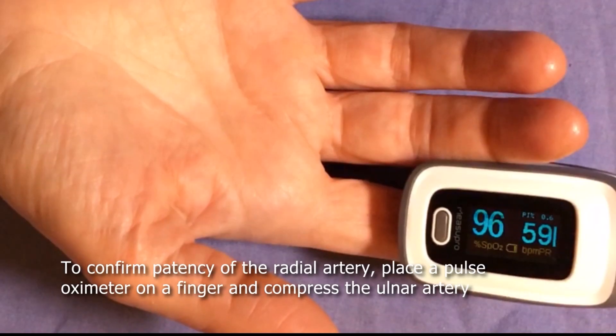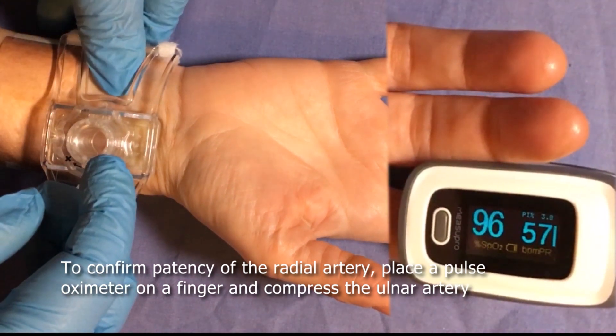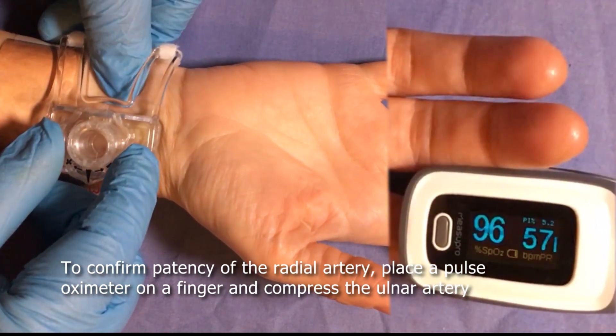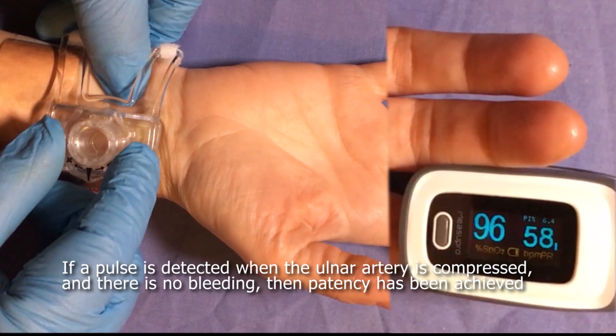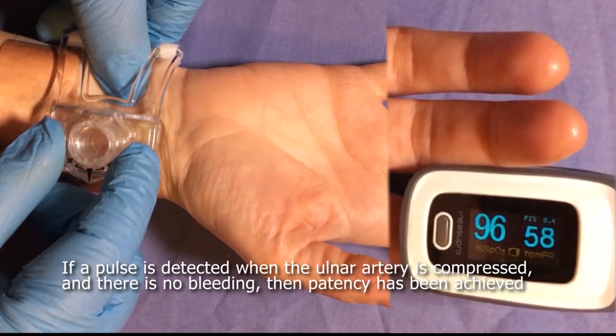Do not apply more than five full turns in total. To confirm patency of the radial artery, place a pulse oximeter on the patient's finger and compress the ulnar artery. If a pulse is detected when the ulnar artery is occluded and there is no bleeding, then patency has been achieved.